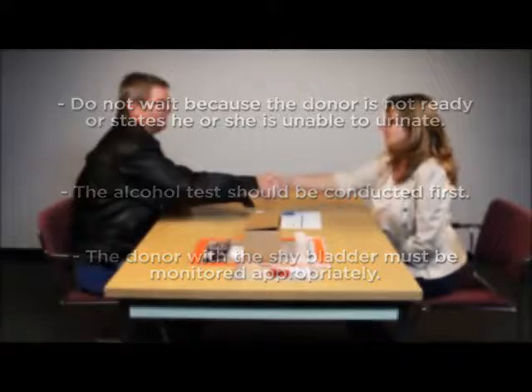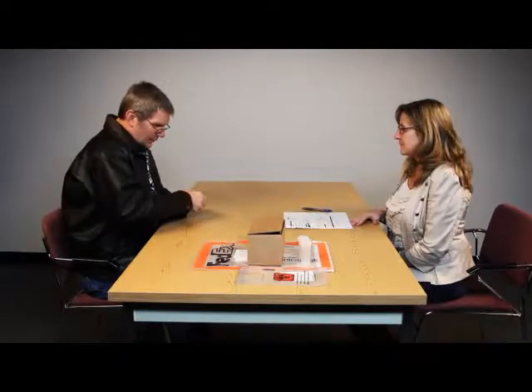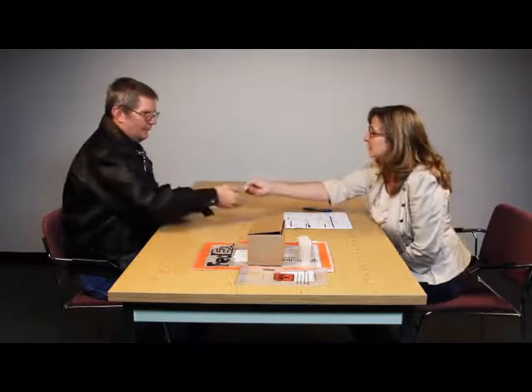Hi John, nice to meet you. Nice to meet you. May I please see a photo ID? Sure. Have the donor provide identification. Positive identification is required before collecting a urine sample. Thank you. Take care to verify that the donor is the same as the individual pictured on the ID.